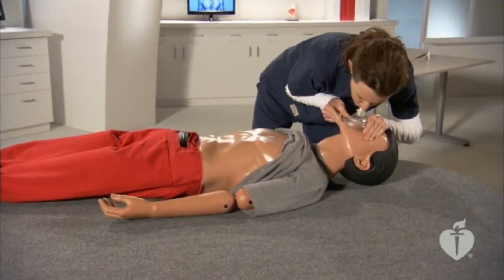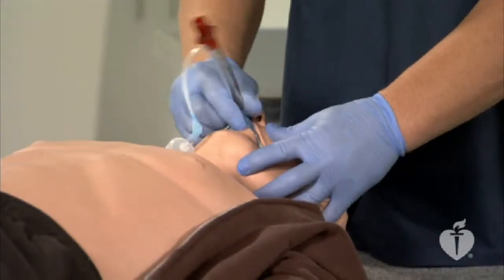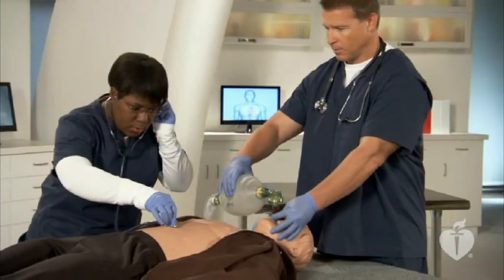Managing a patient's airway is a fundamental life-saving skill, one that both basic and advanced healthcare providers should be able to perform well.